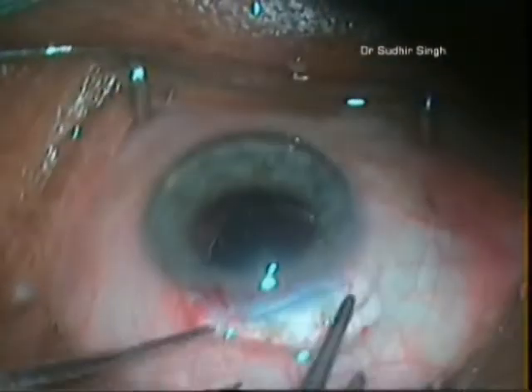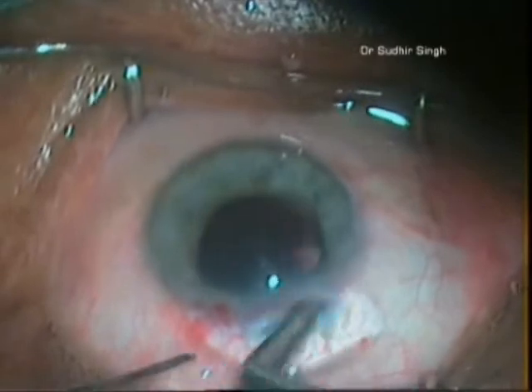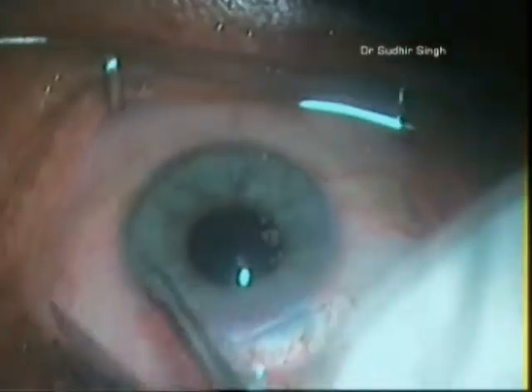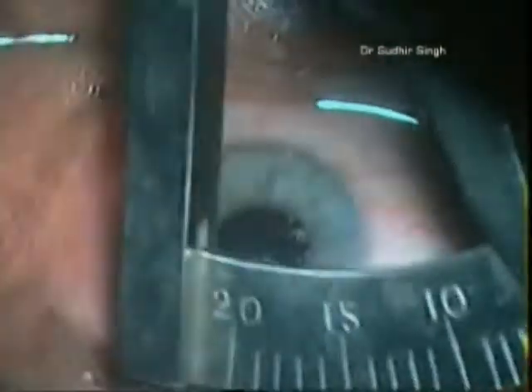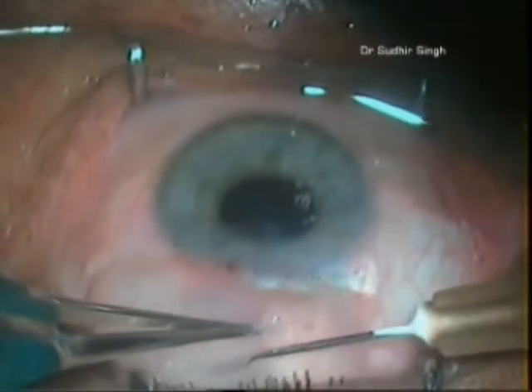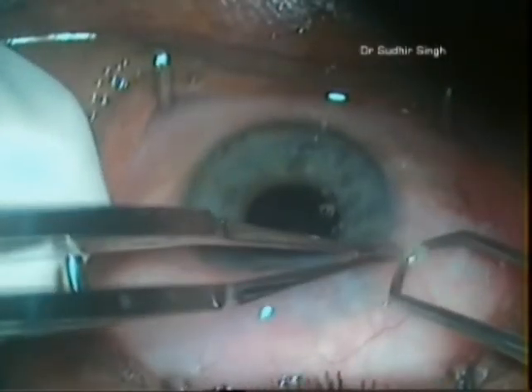A single-piece PMMA intraocular lens is implanted into the capsular bag. First postoperative day, cornea is bright clear with 20/20 vision unaided.